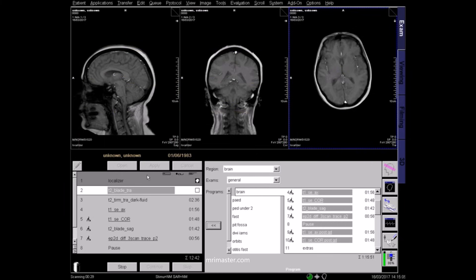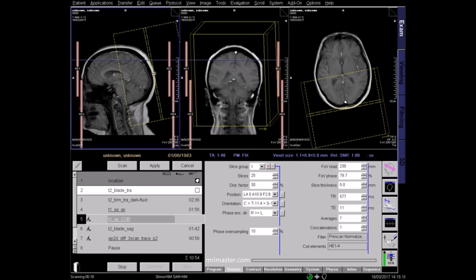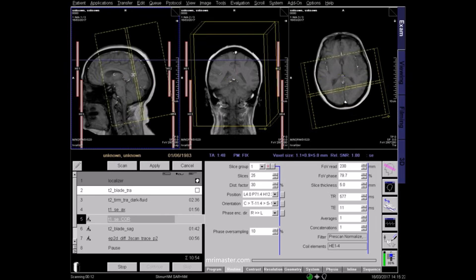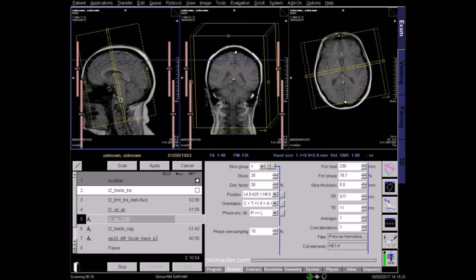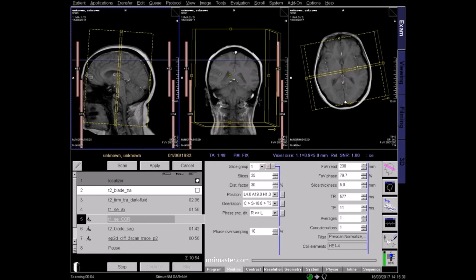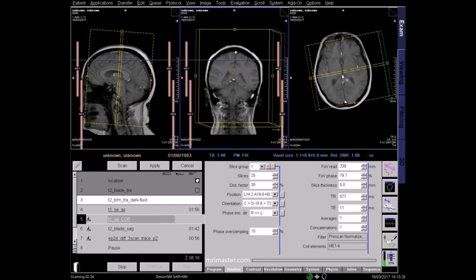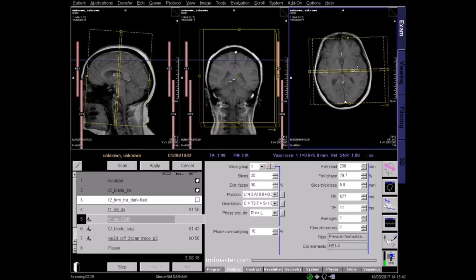Now plan your coronal sequence using all three localizer planes. On the sagittal localizer, the coronal slices should run perpendicular to the line from the genu to the splenium of the corpus callosum. Ensure that the slices cover the entire brain from frontal sinus to the posterior occipital lobe. Center the image in the coronal field of view. On the axial view, the slices should run perpendicular to the midline of the brain, with the centre point lying over the midline.